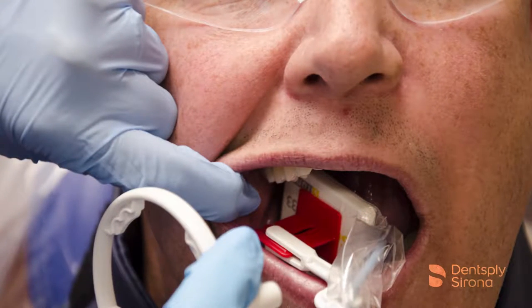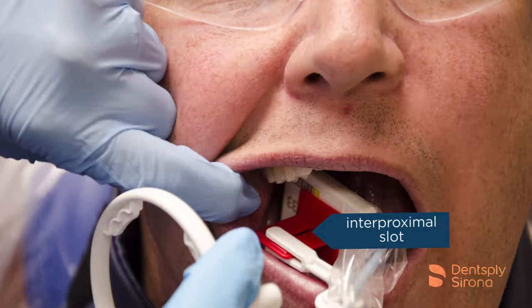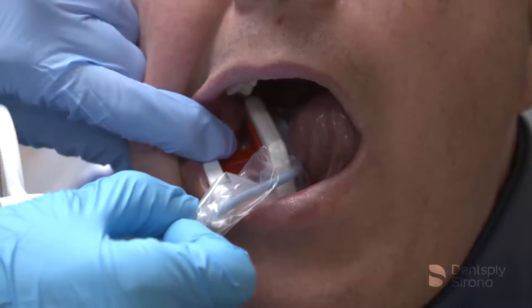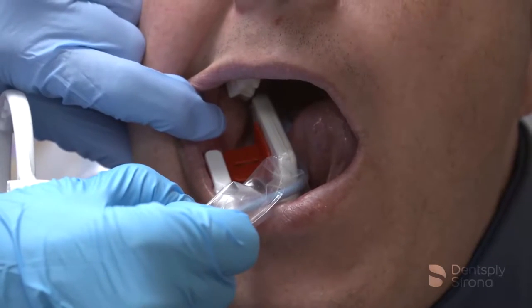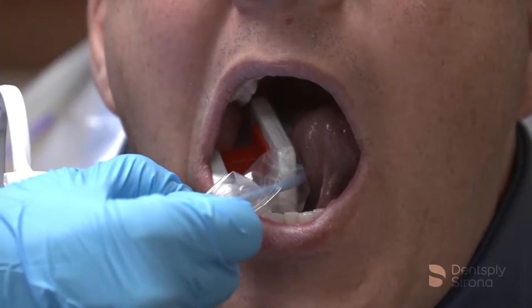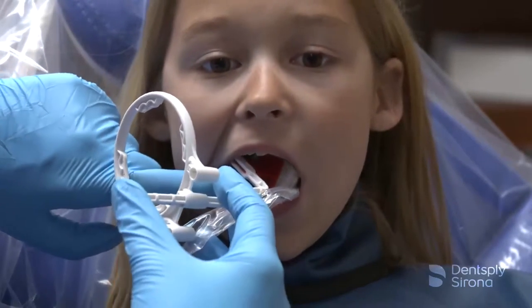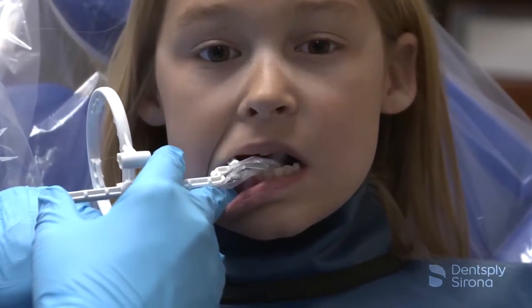Features and benefits include an interproximal positioning slot which aids the clinician in visualizing the central ray being parallel to the interproximal spaces, which will help open the contacts. The base is large and the bite tab is wide, which helps with occlusal engagement and stability. There is improved patient comfort with less bulk.